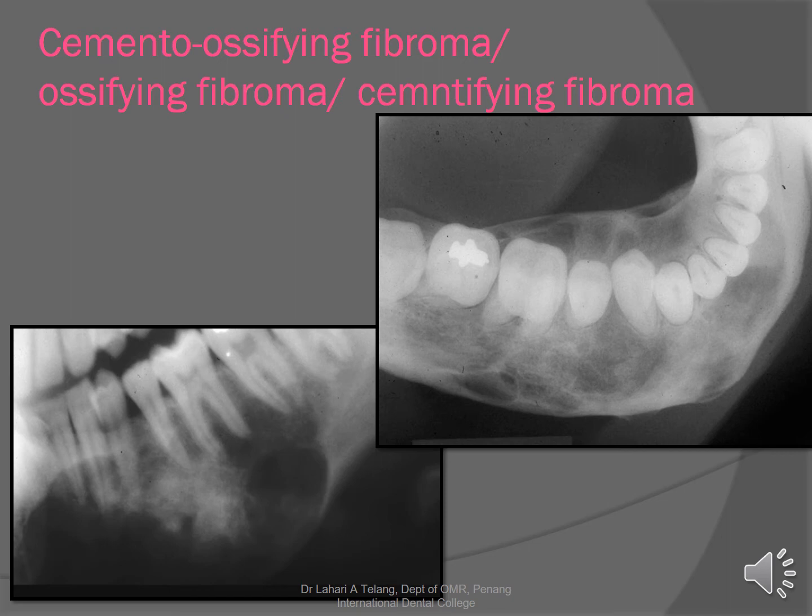Now, all of these are nearly the same disease having different names. So when you're talking about ossifying fibroma, which is a more accepted name, this disease could be radiolucent, radiopaque, or mixed. You can start off as a large radiolucency near the mandibular molar region, or it could be a mixed radiolucent radiopaque lesion.